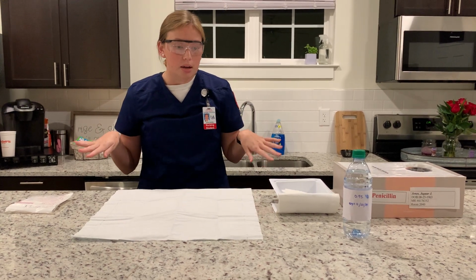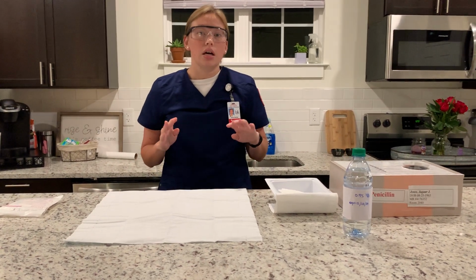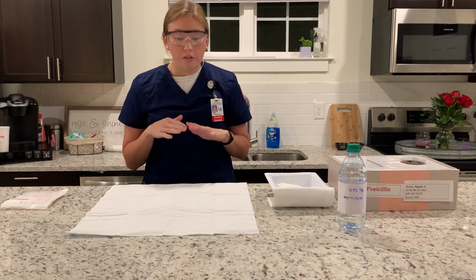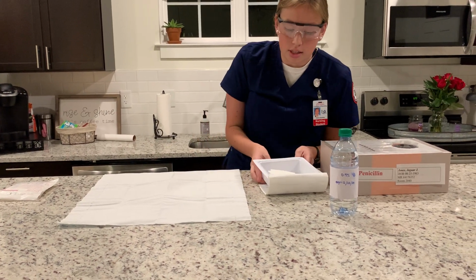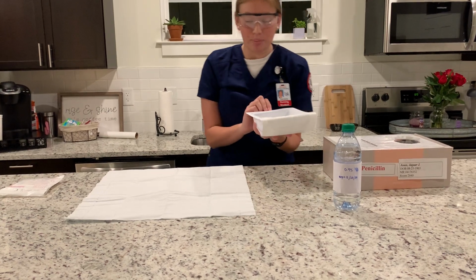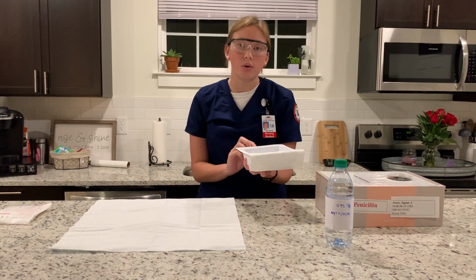Also, I'm at a little bit higher than my waist, which is the level of the table, and so anything below my waist would be contaminated, and so you want to keep your surface above waist level just to keep it sterile. Now I'm going to empty the stuff inside of my container, and I'm going to make sure not to touch the container to the sterile field and to watch out for the 1-inch border around the edge.